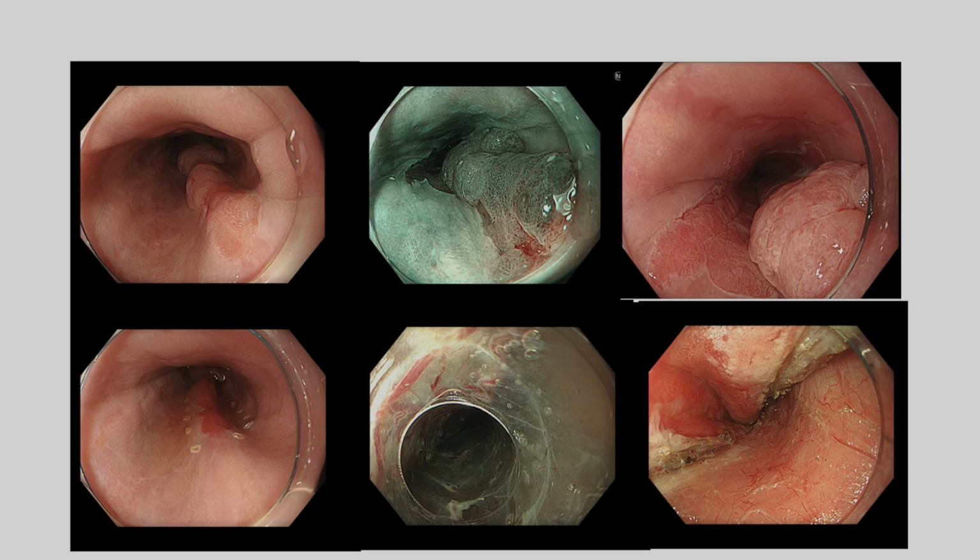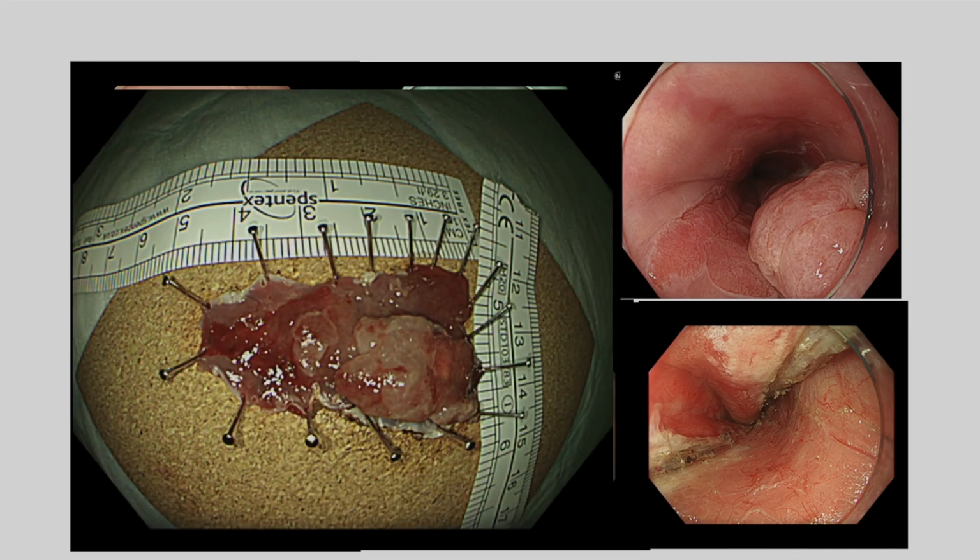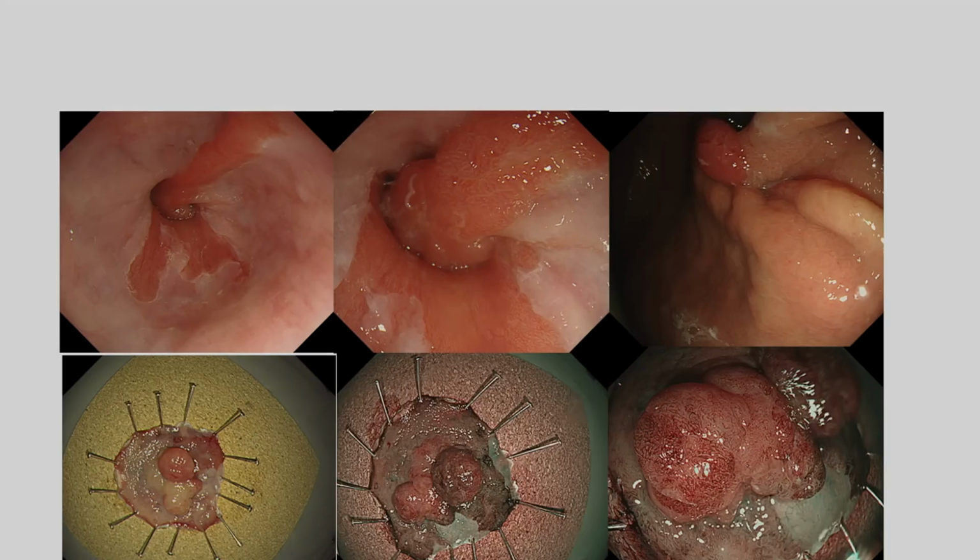You look for nodularity. Anything within the Barrett's that has nodules or ulcerations, you need to treat as abnormal or pathological, intramucosal adenocarcinoma until proven otherwise. And then you can do the treatment. You can resect the lesion, and that is it.